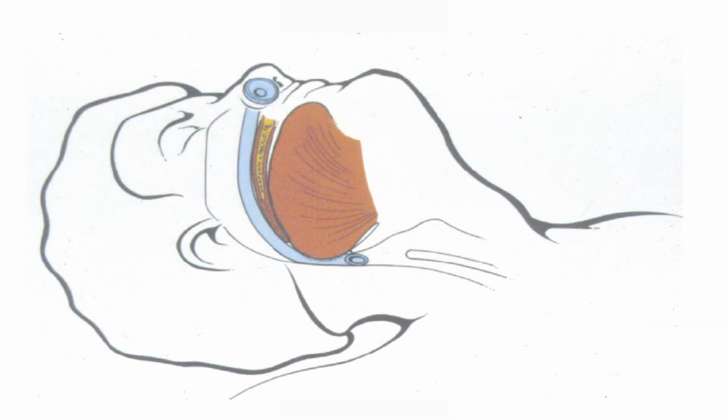Now, when I went to anesthesia school, one of the things we had to do is put in our own nasal airway. They didn't have those nice little soft ones like they have today back in the 70s.